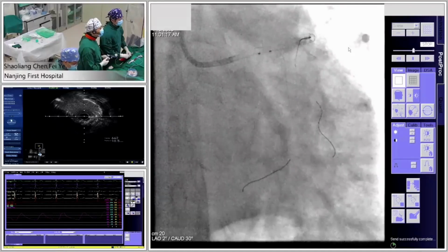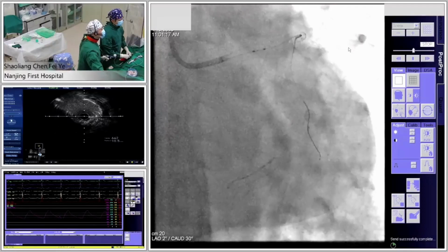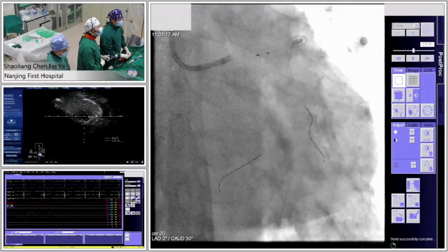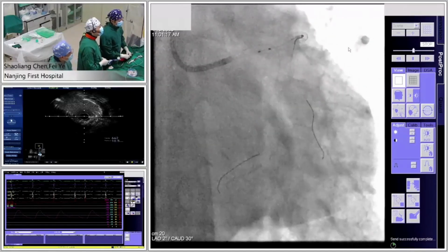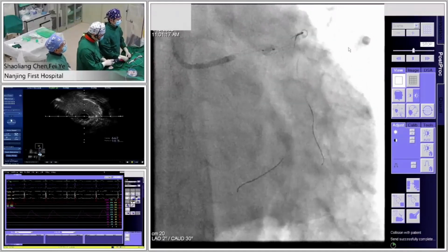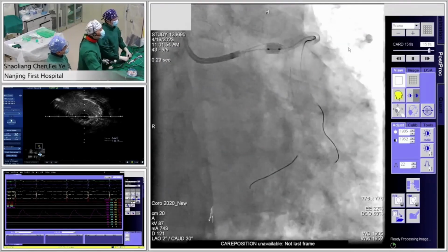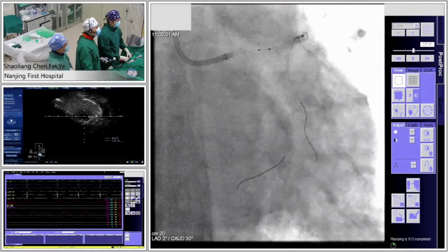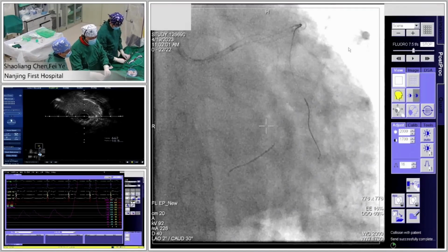So for the report, we will position the balloon just proximal to the POC or just at the POC. We cannot touch the stent carina or carina. Okay, inflation, 14. Yes, enough. Okay, done. This is the final result. We check the angle and we will finish.